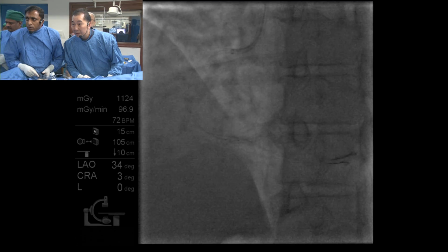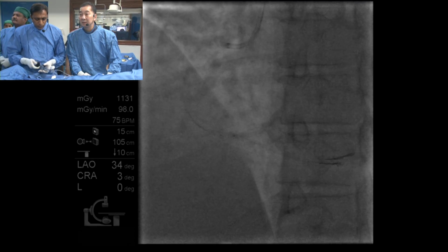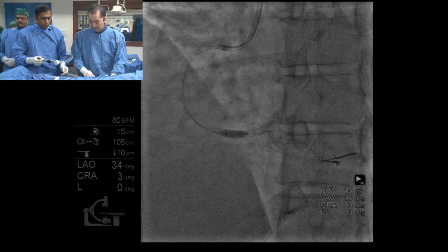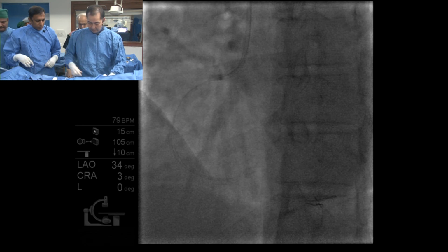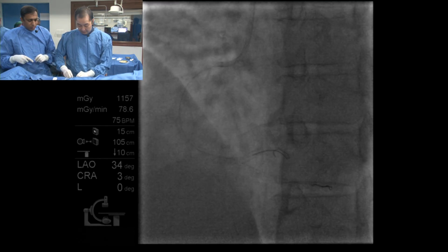The only time I inflate the balloon is if there's no flow in the side branch. Then you inflate the balloon, lift the struts off the side branch, and then rewire the side branch, take the jailed side branch wire out, and then you have to kiss to get the stent deployed properly, get that raised portion of the stent back down, take the side branch wire out, and then take a picture, reopen the ostium with another balloon, and then OCT.